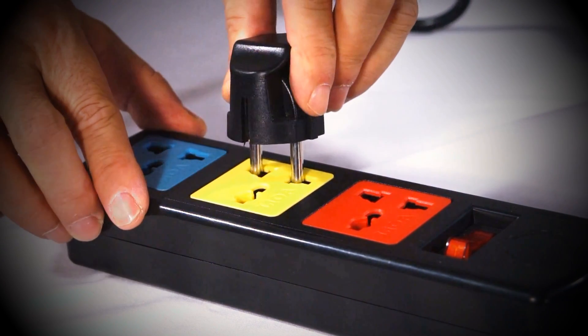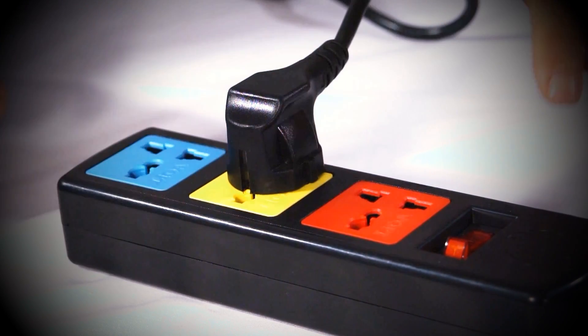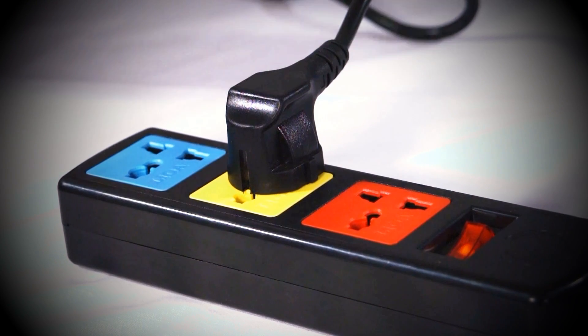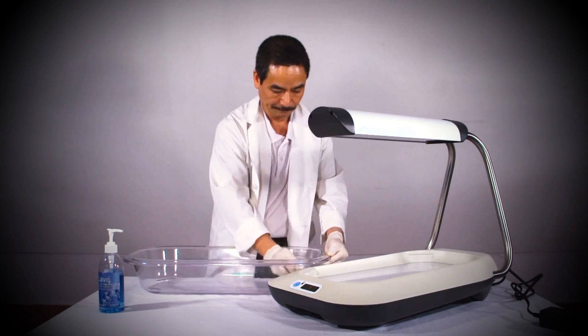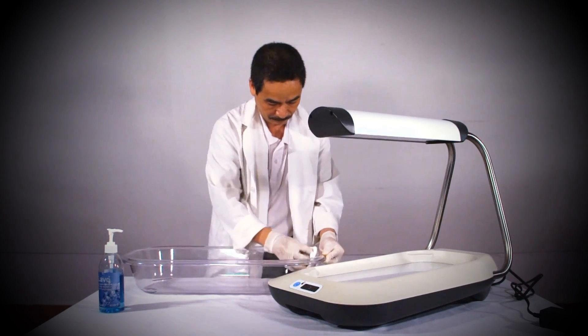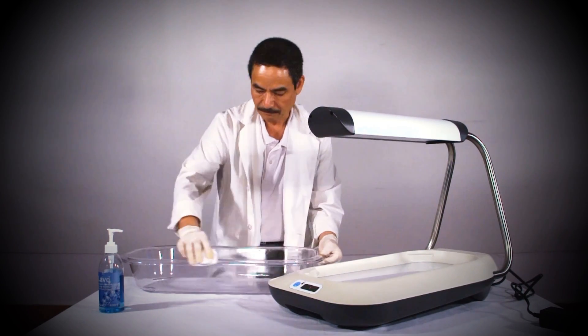Now you can plug the power cord into the electrical outlet. Make sure that the power cord is compatible with your electrical outlet before plugging it in. If it does not fit, please use an appropriate adapter. Once you have plugged the cord into the electrical outlet, the only remaining step before using the unit is to clean the bassinet and the main unit.